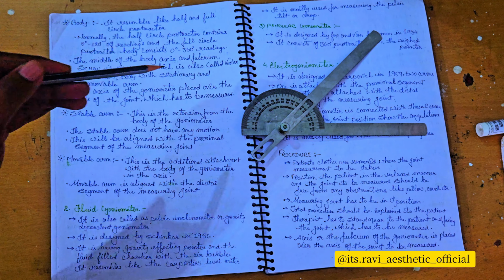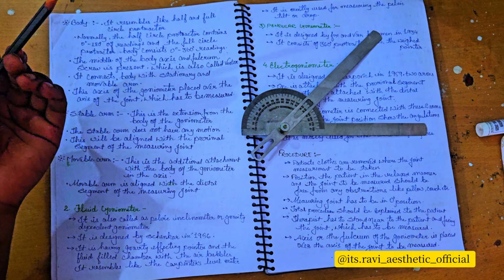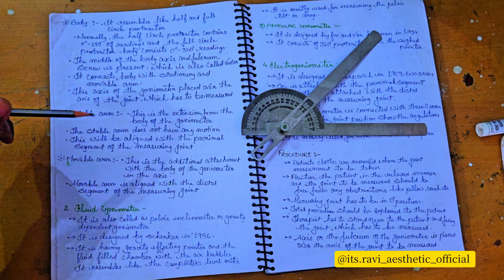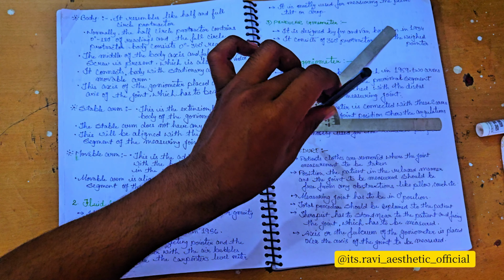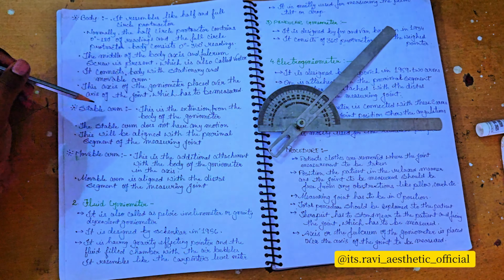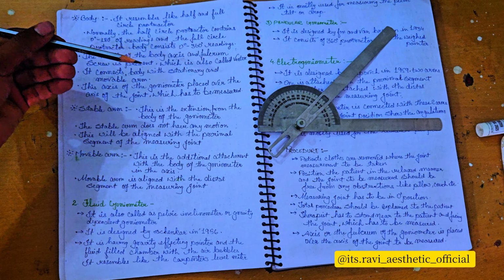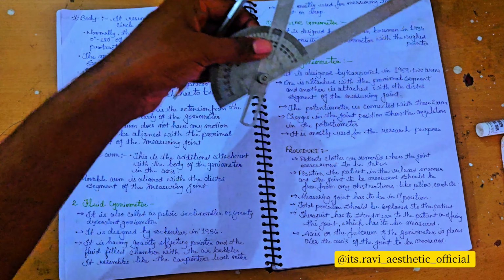So it can measure 360 degrees of movement, like head rotation and circumduction of a joint. In the middle of the body, the axis and fulcrum screw is present, which is also called the vertex. This screw, also called the fulcrum or the vertex, is placed at the joint where we measure the range of motion. So the axis of the goniometer is placed over the axis of the joint which has to be measured, like the axis of the joint for measuring flexion and extension.